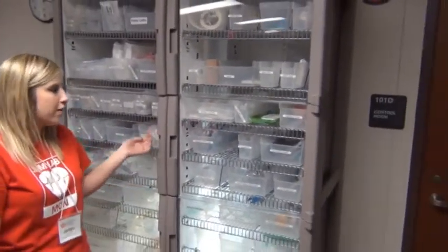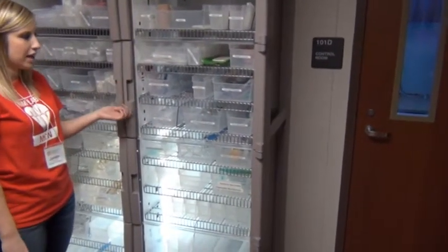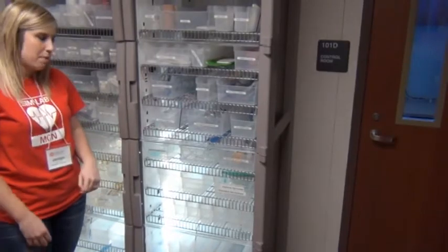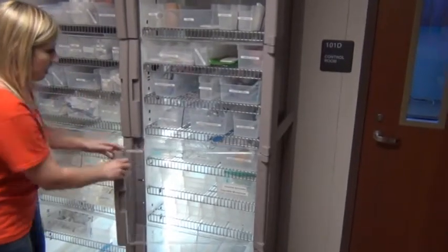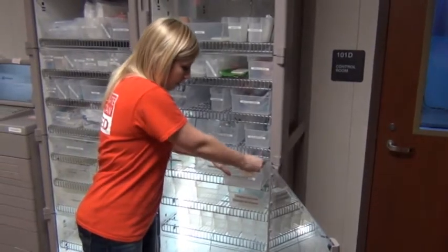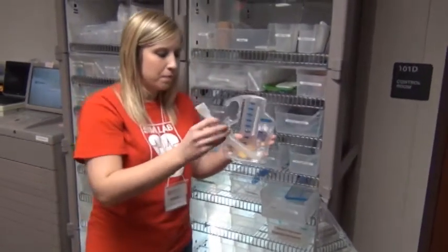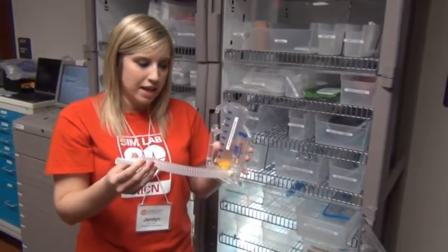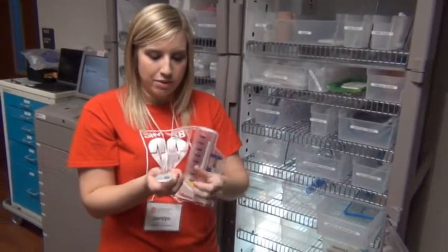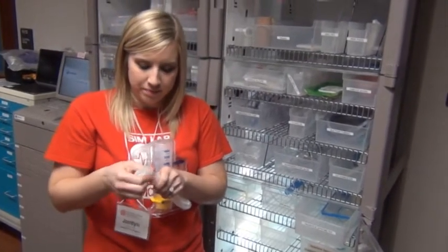And then over here we have all of our respiratory equipment. So you'll have your masks, your nasal cannulas, and any suctioning tubing you may need. If your patient calls for an incentive spirometer, you'll come here and you'll get this out. If it's a standardized patient, they can actually use this because the mouthpieces are disposable. So they just come right off.